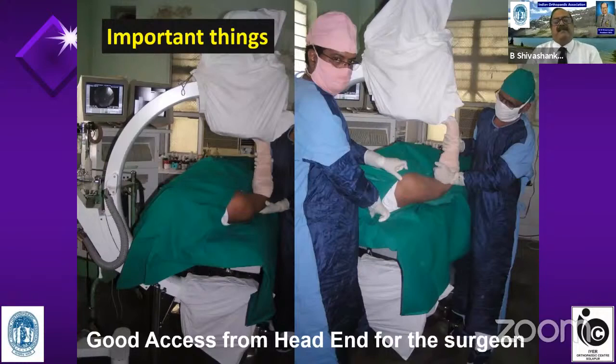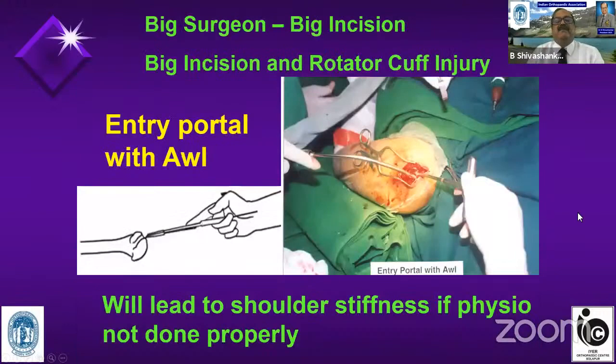Some of the important things are: you have to operate from the head end of the patient. So the C-arm comes from the opposite side, and both AP and lateral can be taken in the same C-arm position without moving the C-arm. As you can see, I normally pass a guide pin as a joystick into the proximal fragment. The assistant also will just give traction from the distal end.